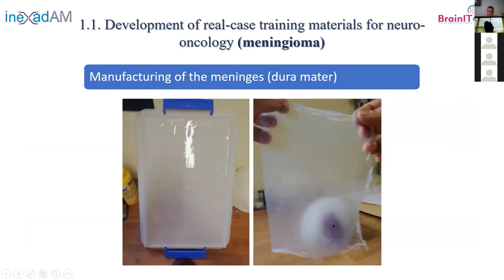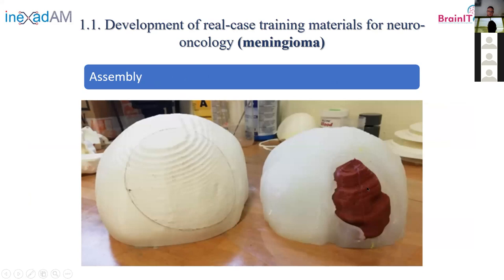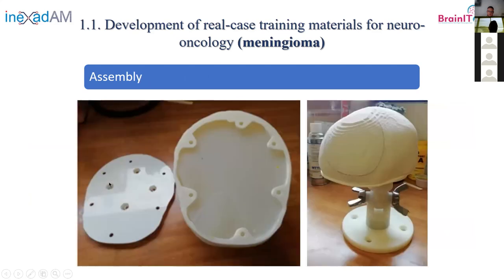In the background you can see the brain. We put the tumor inside the brain, and this is the meninges that we placed on the brain. We placed the meninges — the duramater — over the brain, then placed the brain inside the skull and closed it with screws. Finally, using the holes, we tied the complete skull to the holder that allows orientation of the synthetic models for the training session.